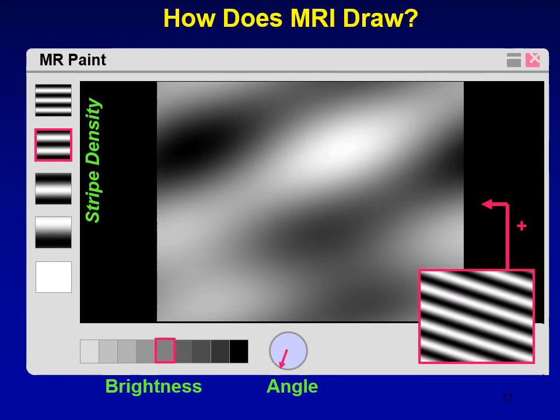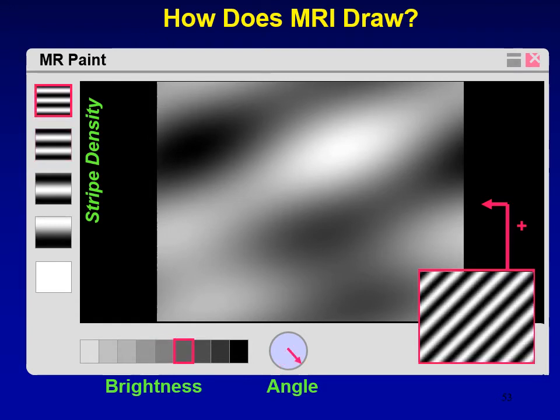Over the next several slides, more and more data of different frequencies, intensities, and angles is added to the reconstructed image until ultimately we get the final reconstruction. This will be illustrated in the series of the next several slides. With each slide, the new data that is being added is shown in the bottom right-hand corner, and the resultant reconstruction at that point in time is shown across the center of the image.